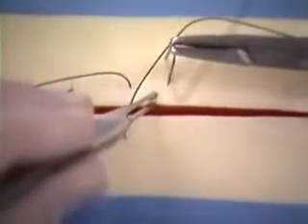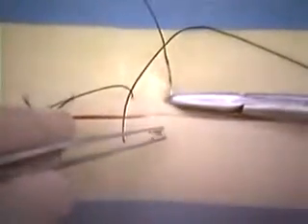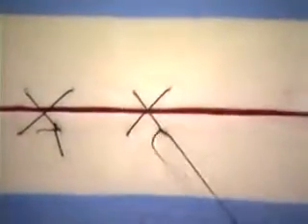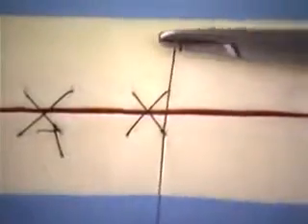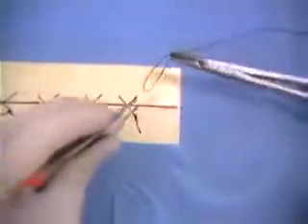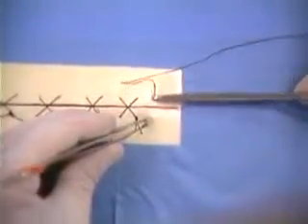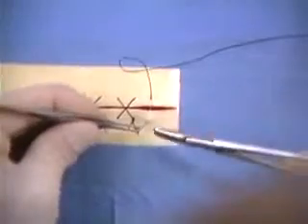The needle is introduced on one side 5 millimeters from the incision and is passed to the corresponding point on the opposite side. The needle is then advanced approximately 5 to 7 millimeters and is passed across the incision line without entering the tissues. A second passage is made through the tissue parallel to the first passage.